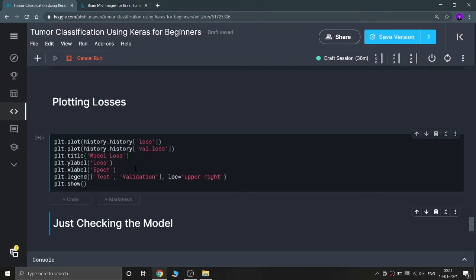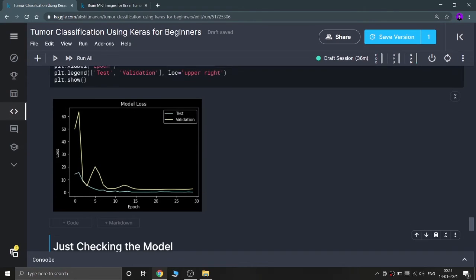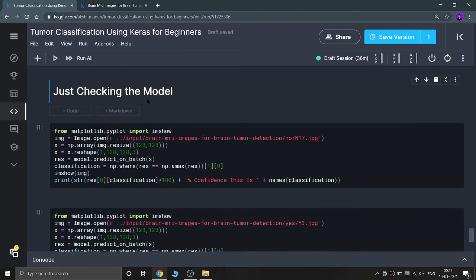Now I check the model on a random image from the tumor detection folder. Using matplotlib, I open the image, convert it to a numpy array, reshape it to (1, 128, 128, 3), and run a prediction. The classification picks the value with the maximum confidence from the two outputs — zero means tumor, one means not having a tumor — and prints the predicted class with the confidence level.